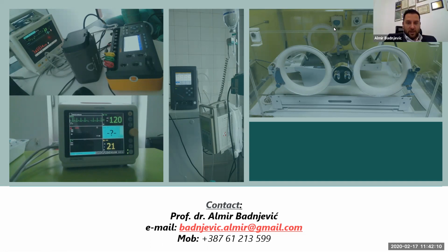Okay, I can answer the first question. I have a question from Pedro Gonzalez. He asked, why are you using the term verification instead of calibration? Verification and calibration are not the same terms. Verification or inspection is defined per ISO 17020, while calibration is defined per ISO 17025. They are two totally different terms. Calibration is when you want to check and fix the device to make it work well, and then you get the numbers with your traceability, of course, and all your measurements with the established measurement uncertainty.